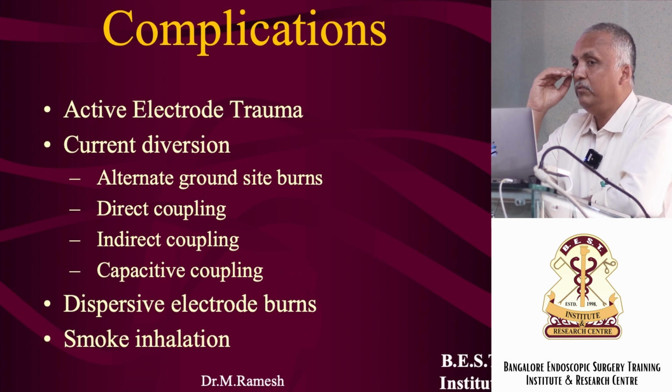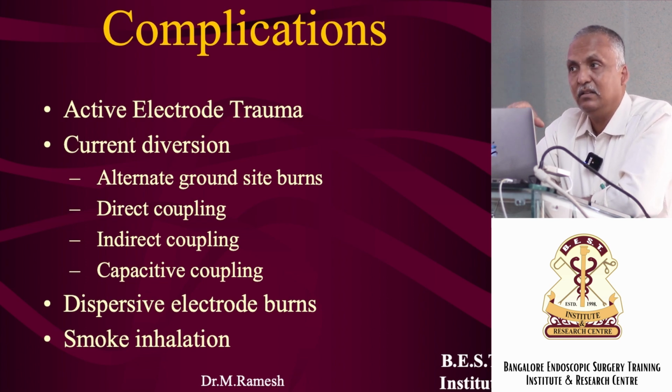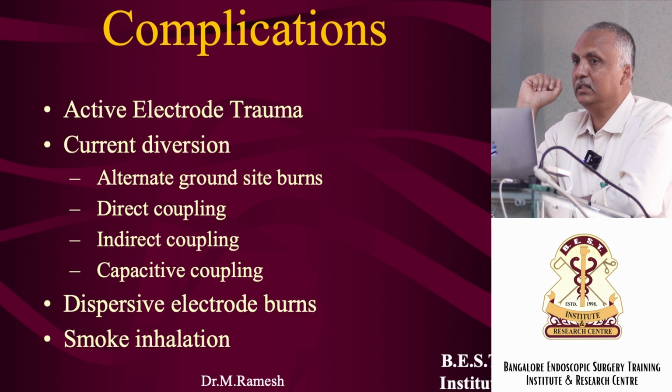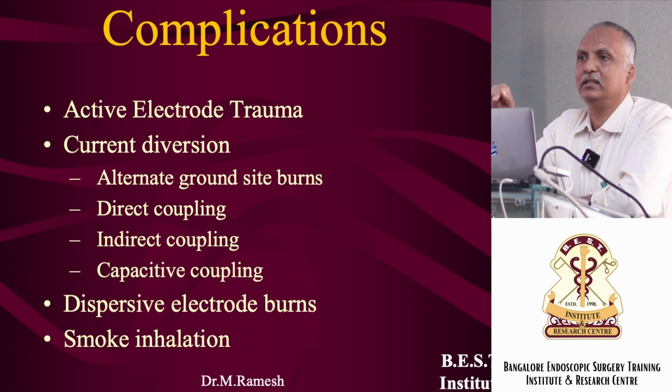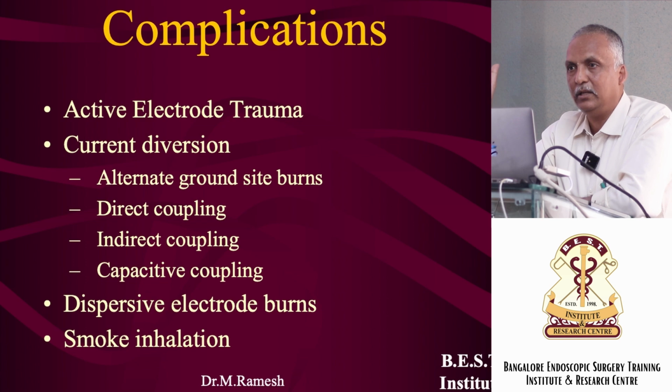Now we had this black plate, the silicon plate which was coming with the L&T machine. What was the difference between the metal plate and the black plate? The size was smaller; the metal plate was much bigger. The black plate became slightly smaller. It was like a rubber plate, if you all remember.